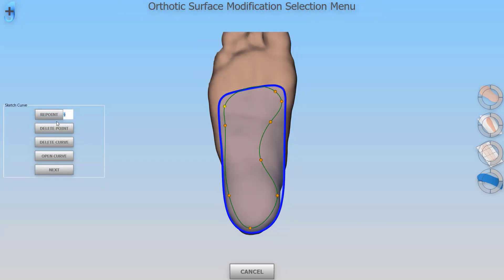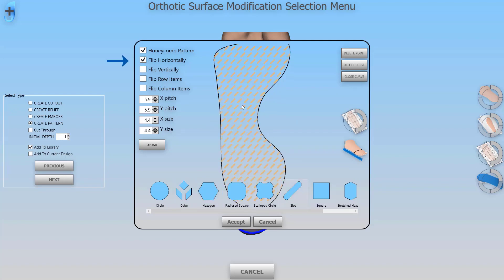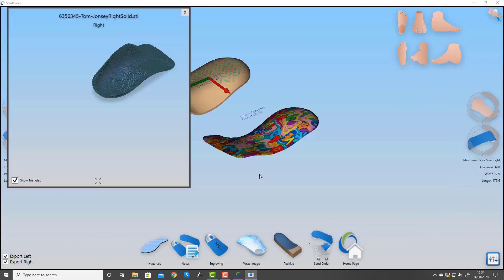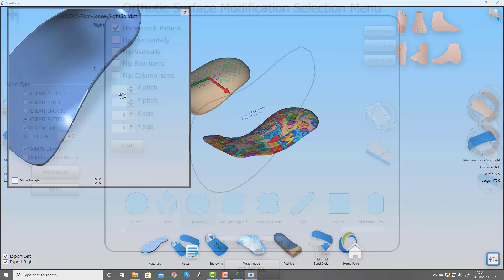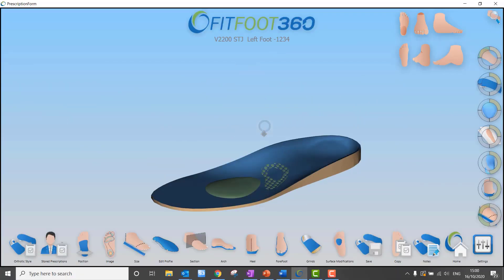In version 2.1 we added the pattern design tool, which enables you to create any shape you want and position it, and we added the ability to view items that have been designed. Now in version 3 there is a new addition to the pattern tool that allows you to put islands in your patterns, so you can create much more complex shapes on the bottom of the surface.